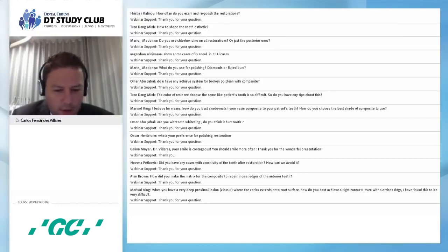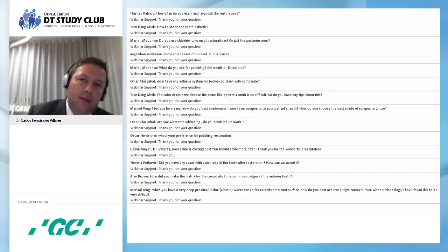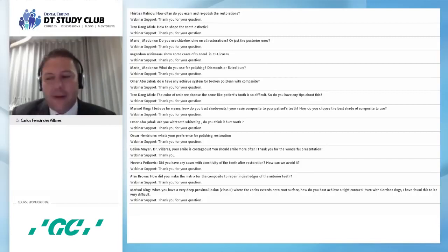Canute, how can we deal with bleeding that happens after flossing, or during cementation of veneers? If you don't want to have problems during cementation of veneers, please use the rubber dam, floss it and put it with a knot. Another good trick is to give the patient chlorhexidine for 1 week during the provisional phase. Then you will have fewer problems during cementation. But what I try to do is to be first, that means be faster than the blood. The blood is always there, and we need to avoid it.